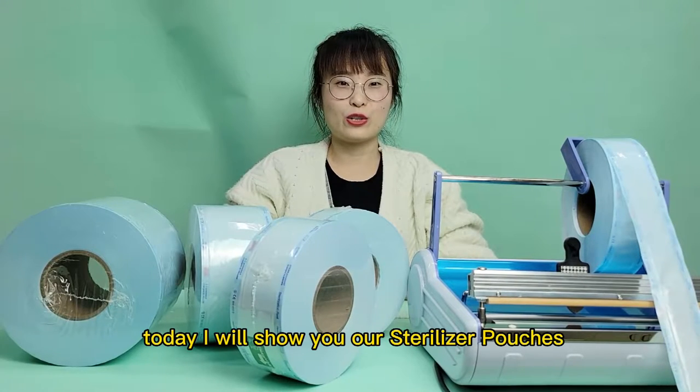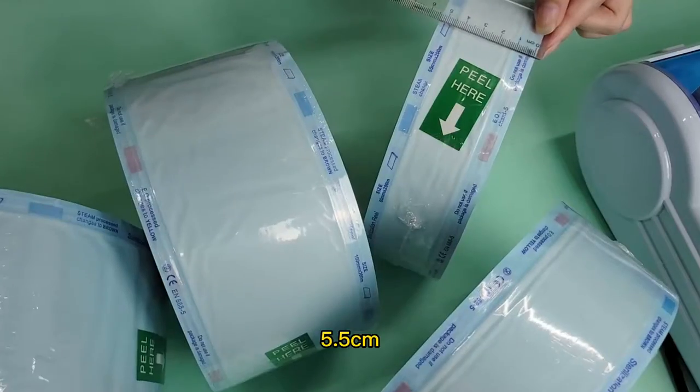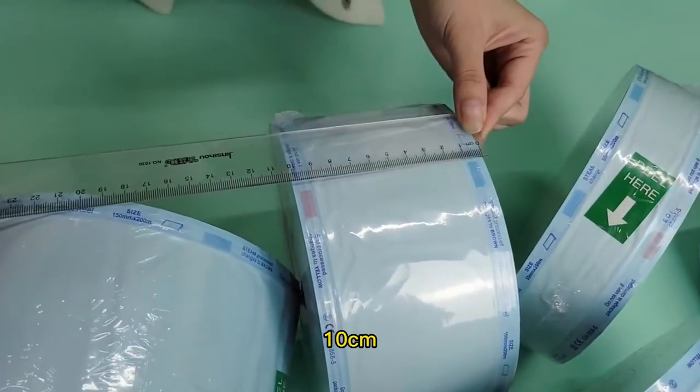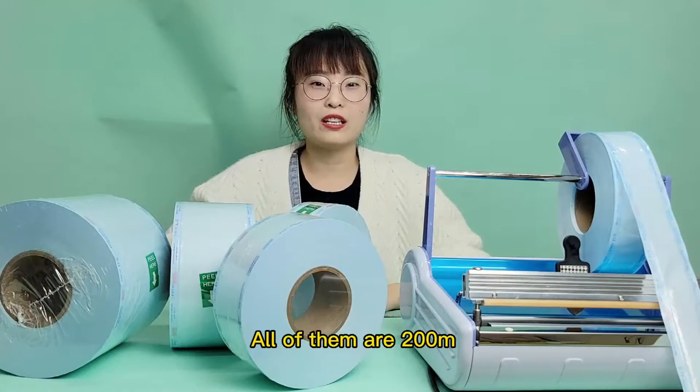Hi friends, today I will show you our sterilizer pouches. We have five different models: 5.5, 7.5, 10, 15, and 20. All of them are 200 meters.